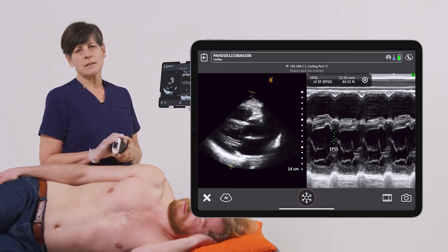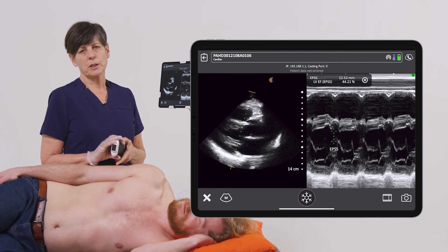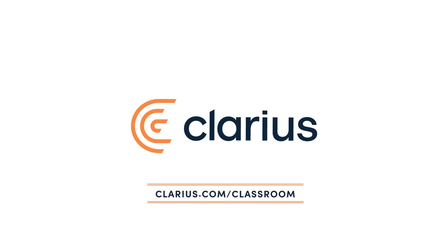So you can see a quick estimate of left ventricular ejection fraction can be done with the EPSS measurement. Thank you.